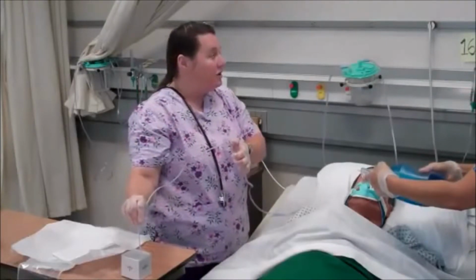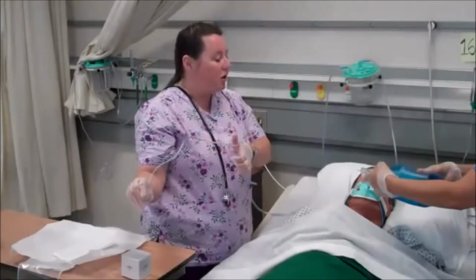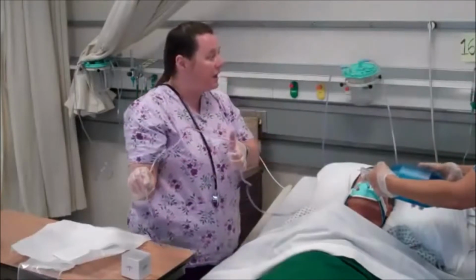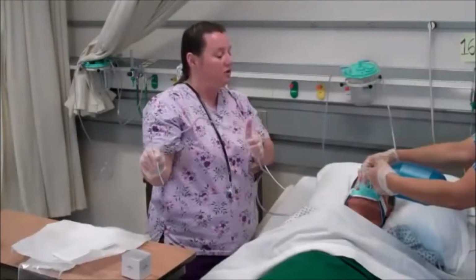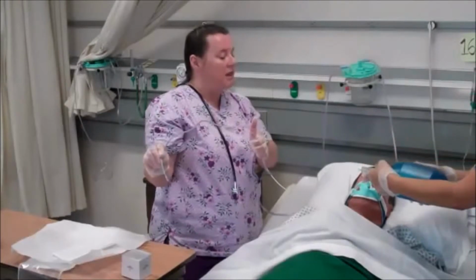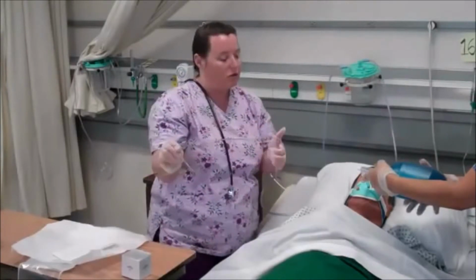I'm going to check my monitor here to see if the oxygen saturation has come up, if the heart rate has increased at all with that procedure, which is a normal finding, that it's come down to its baseline and that no arrhythmias are present. If I have stimulated any type of arrhythmia, I would want to stop the procedure and get the patient to baseline. My oxygen saturation has come up a little bit. It's not at his normal saturation yet. His condition appears like it would warrant a second pass.